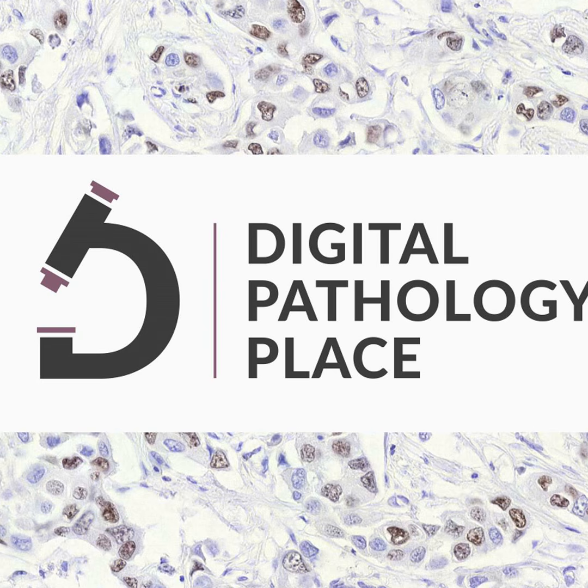And there is one system, Hologic Genius, and that is cleared, not approved. I checked. But this is FDA terminology, regulatory terminology. This is the only one that is cleared by the FDA for routine clinical screening of cervical cytology in the United States. So we're still in cervical cytology, right? The beautiful looking thin prep.